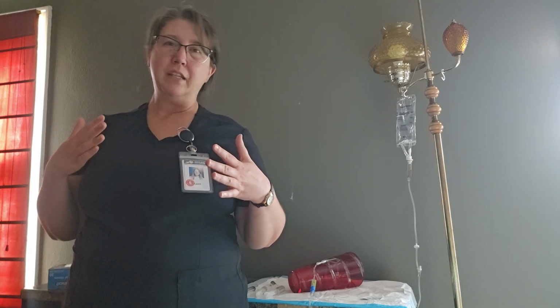Now, I'm going to see that the patient is already getting an IV currently, and I'm also going to make sure that there is a compatibility with that IV, and if not, I'm going to take precautions.